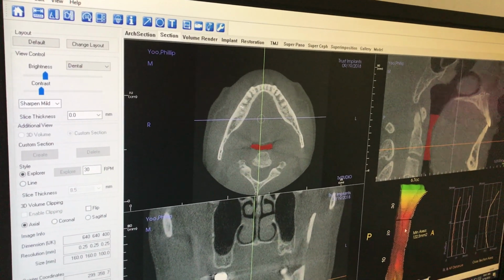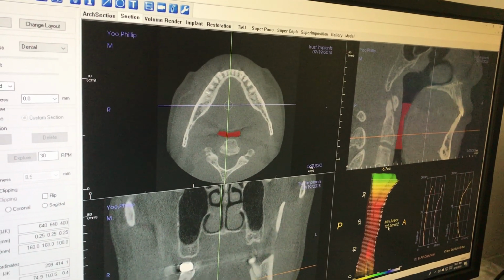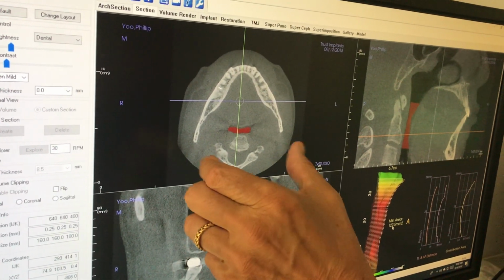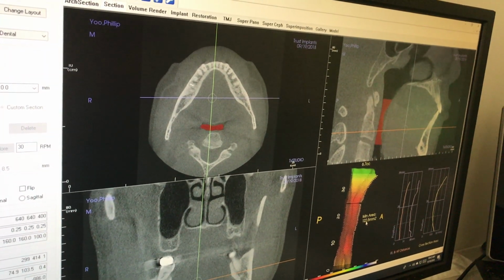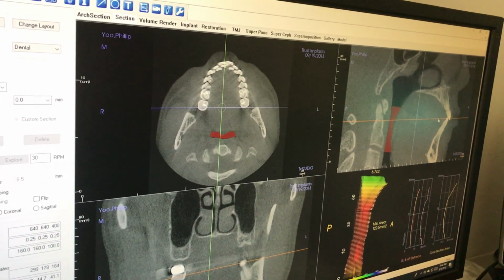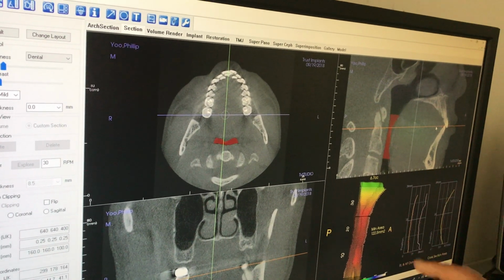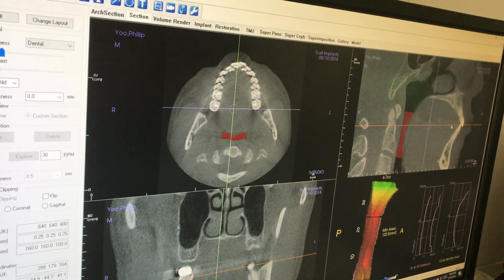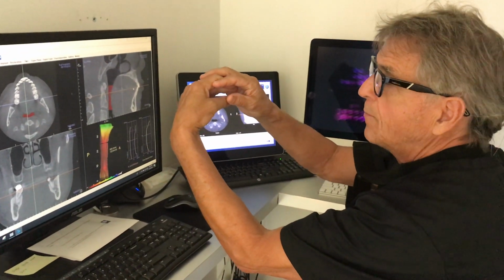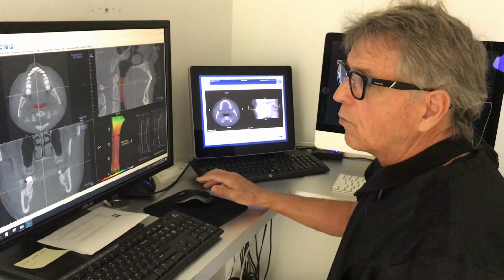Okay. And you have an opening of 122 millimeters. You should have about 160, but it's not just the size you have, it's the shape, and your shape is much more likely to collapse than someone who may even have a smaller area but is circular. So the flatness of the airway allows it to collapse better, and you're below what we would like to see.